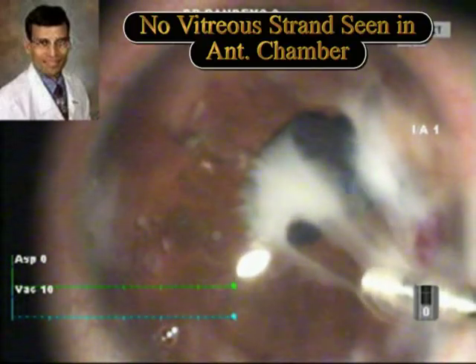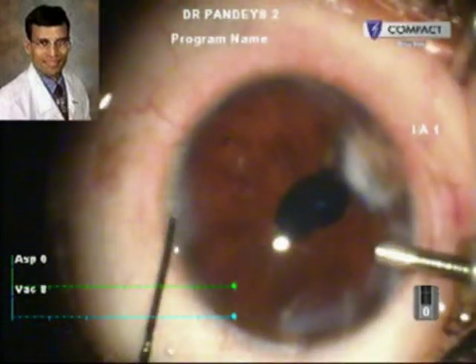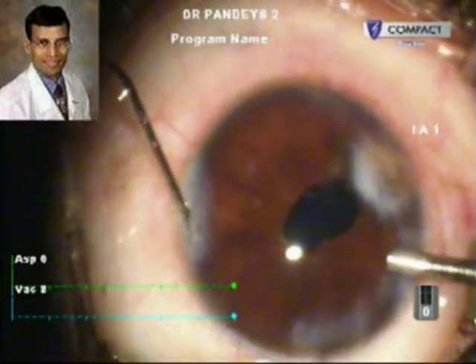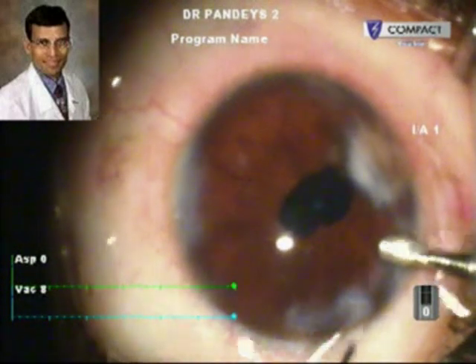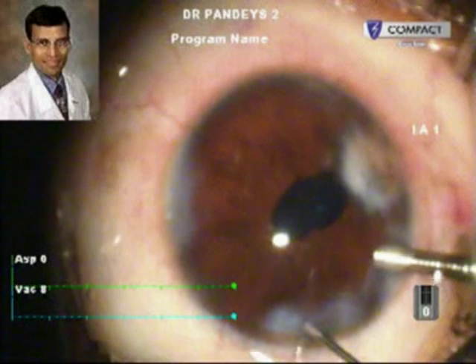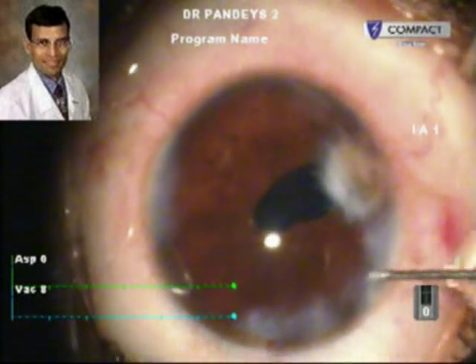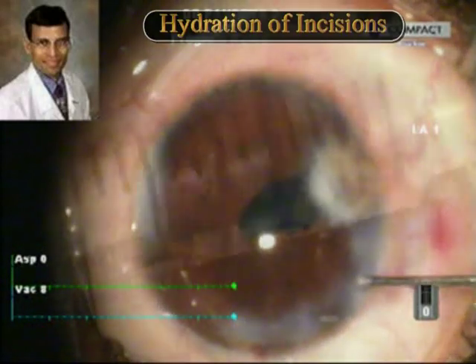Intracameral preservative-free triamcinolone was used to stain any vitreous strands in the anterior chamber so that they could be removed. However, in this case no vitreous strands were seen. After this, the incisions were hydrated to seal them. Here you can see the incisions are being sealed. In these cases, we perform cataract surgery normally around 6 weeks after the initial perforation repair, because by that time the inflammation has subsided.